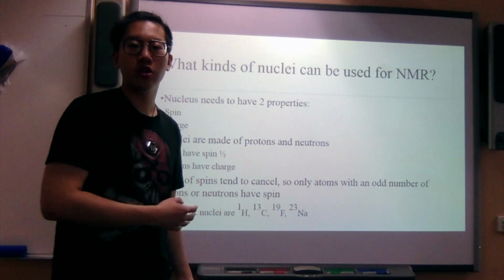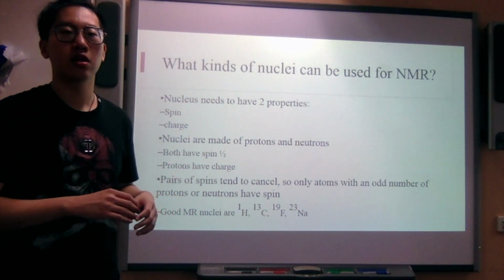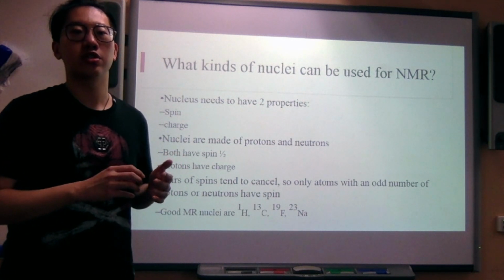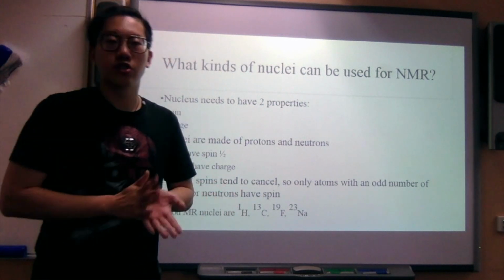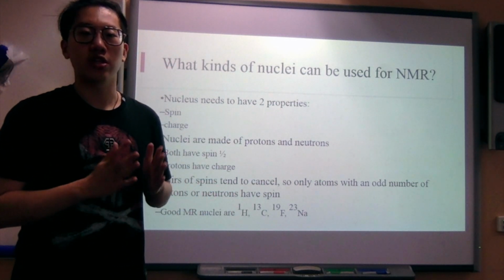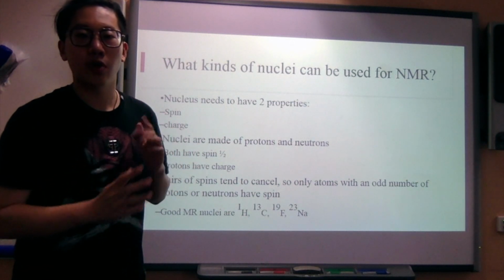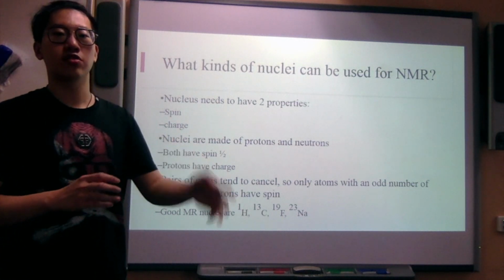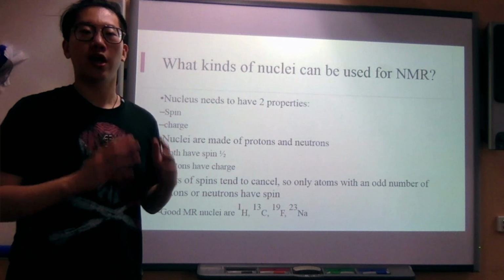And among these four atoms, hydrogen is best for MRI because the hydrogen atom is the only major species that is MR sensitive. And hydrogen is the most abundant atom in the body. Most of the hydrogen atoms in the body are in water, which is H2O. And essentially, nowadays all MRI uses hydrogen imaging.